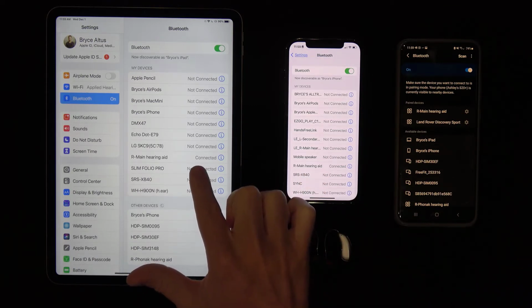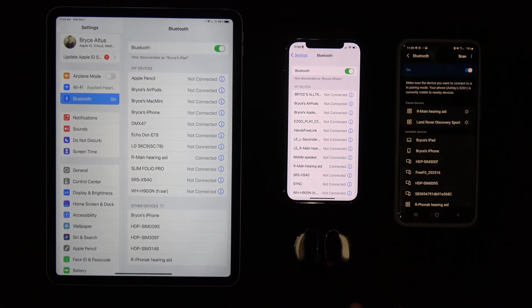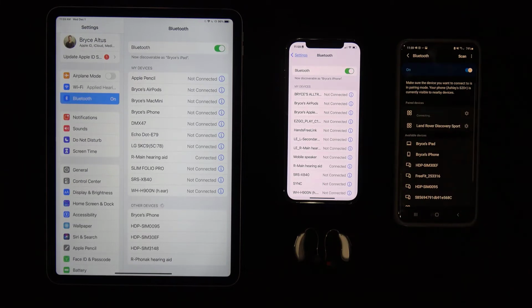Here we see that both the iPhone and the iPad are connected, but the Android is saying that we need to tap on the name of the hearing aid in order to then connect to the device. When using Paradise hearing aids from Phonak, with just two devices, let's say the iPad and the iPhone.